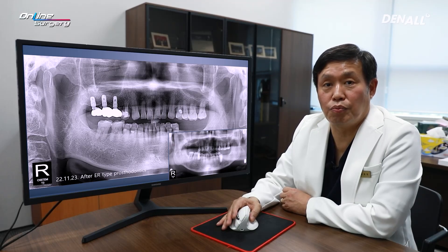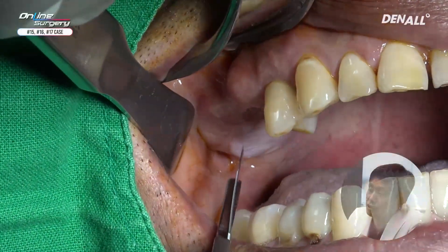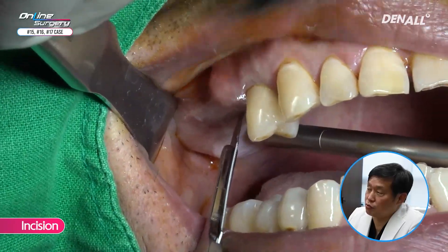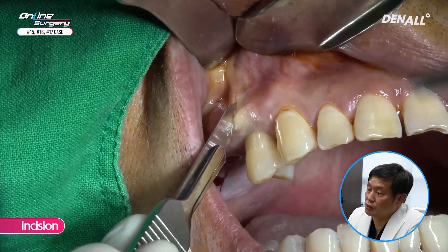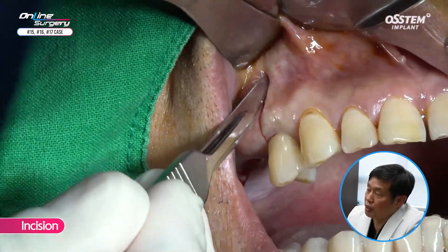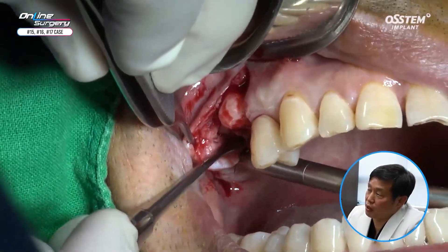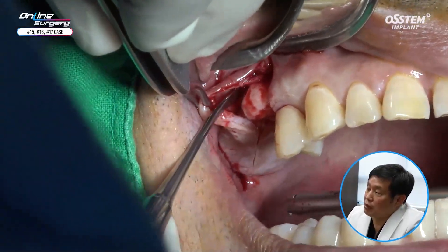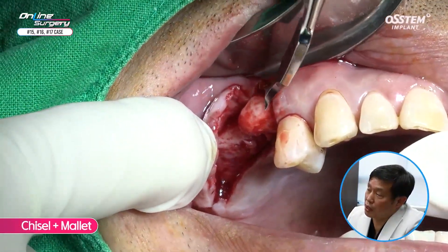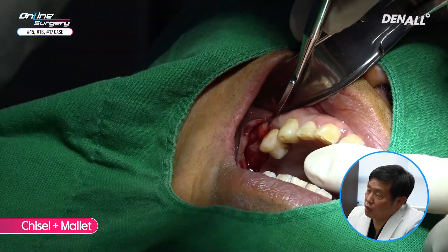Let's look at the surgical clip. The incision was made. In the case of the posterior area, I use the blade like this. From the distal side, I am making a vertical incision from top to down, though if it is difficult you can do it the other way around. There is exostosis here and the flap can be thin, so we need to detach the flap carefully so that it does not tear. The flap is reflected and, as mentioned, number 15 has exostosis.